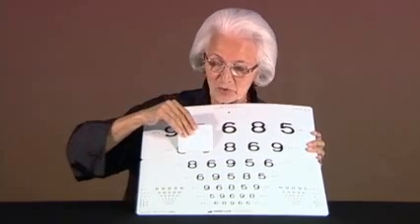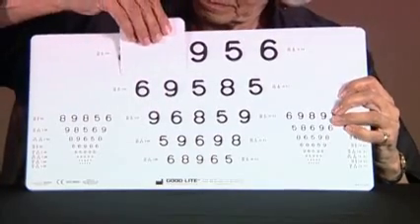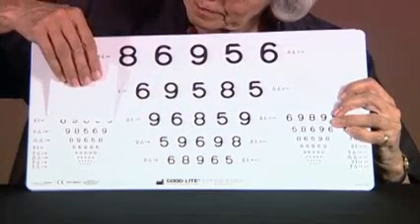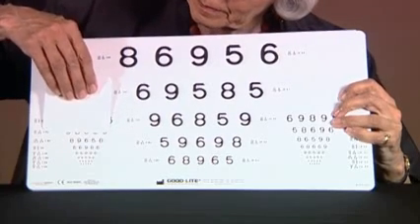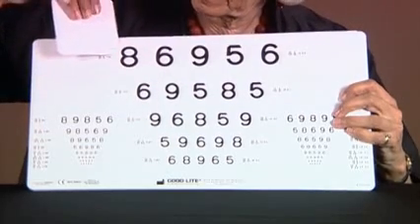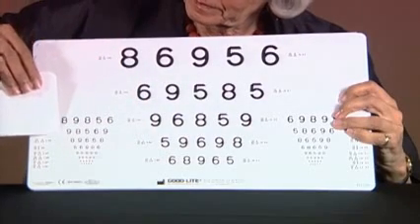We ask what is the first number on each line, and then we come to the level where the person answers incorrectly or is hesitant. We then go one line up and ask the person to answer all the numbers on that line. If they get 3 out of 5 correct, we move to the next line to check whether focusing has become more careful.